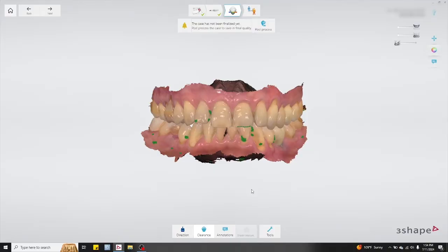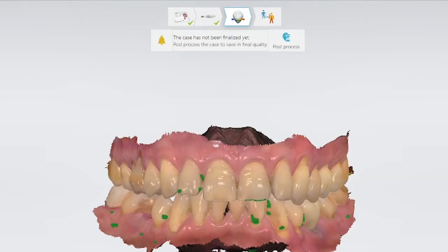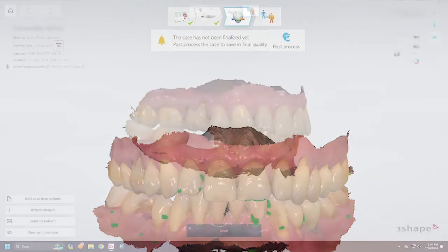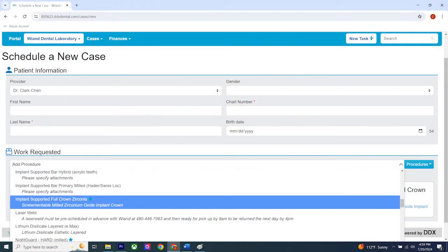Have your faculty check your scans before clicking the post process button, because once you click post process you won't be able to edit those scans anymore. After that, proceed to the next window and hit send to send the scan to the lab. Be sure to fill out a DDX lab prescription, have it approved and printed out, and place it in an empty lab box so it's ready for pickup. Be sure to schedule your patient's delivery appointment appropriately based on that lab's turnaround time.